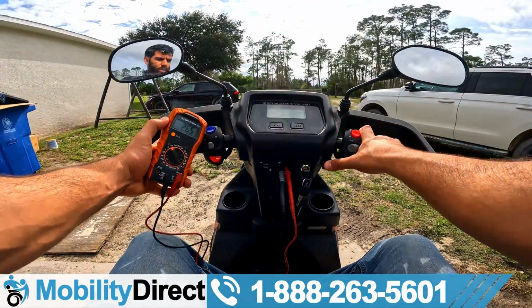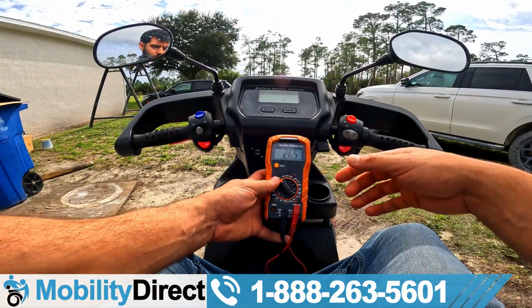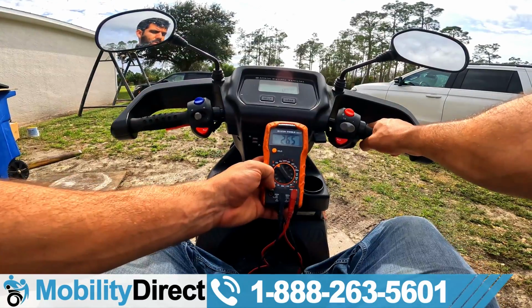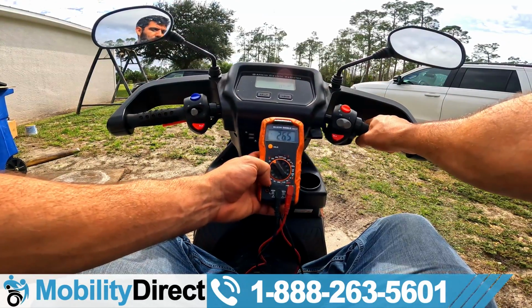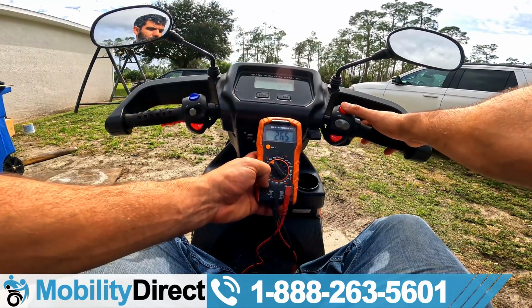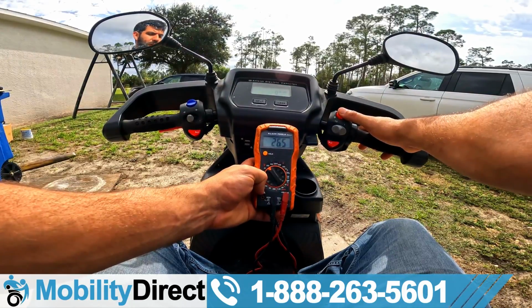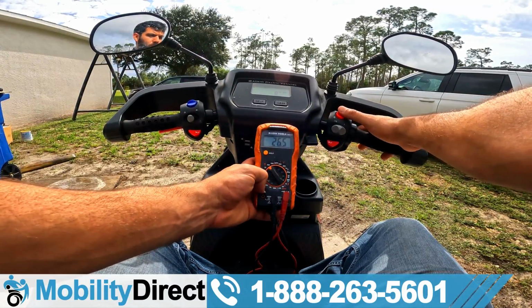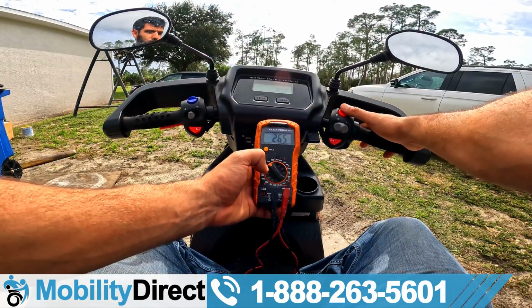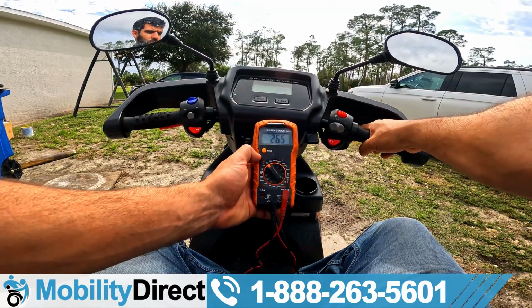But what I want to do is make sure that as I'm riding, that stays consistent at around 26 or, you know, close to 26, maybe a little bit lower than 26 as I'm going. If it starts to drop down to 24, that's why it's losing power and turning off. That means your batteries aren't able to hold a charge under a load, meaning when it's moving. So at 26.5 stationary, that's great. That's enough power. But let's see what happens when I start moving forward.